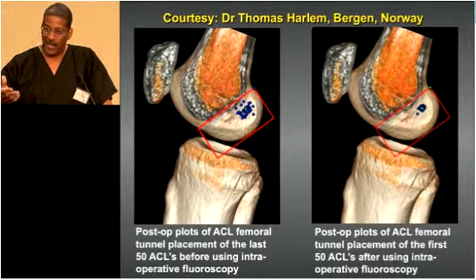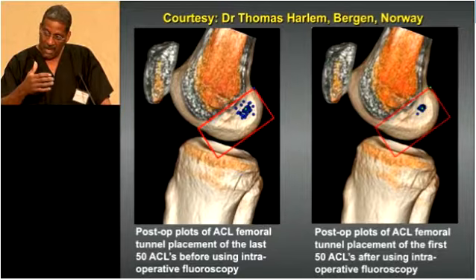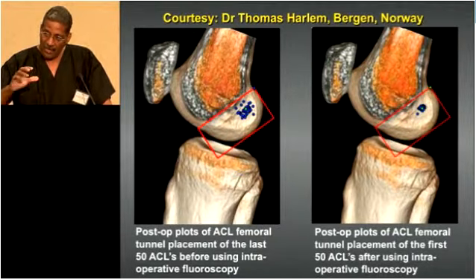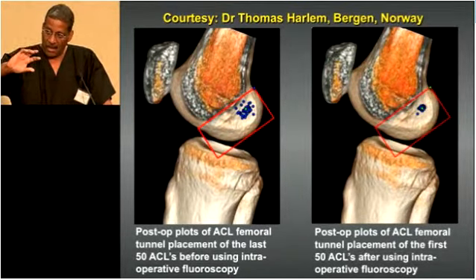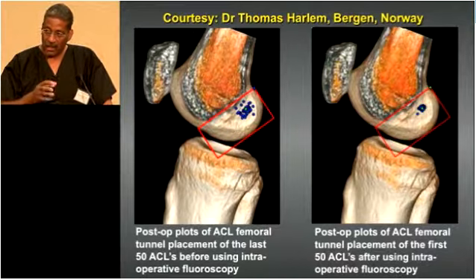So at the end of the day, each surgeon has to figure out what their philosophy is, where you want to be, and you have to make a choice. Not every knee gets the same, and I adjust these sometimes. If I have a real big pivot, I may give them a little bit more PL. If I have a smaller pivot, I may move the tunnel in the AM bundle position between the center. So you can basically do a la carte surgery if you know where the tunnel is, and this gives you a reliable way of knowing your tunnel placements.